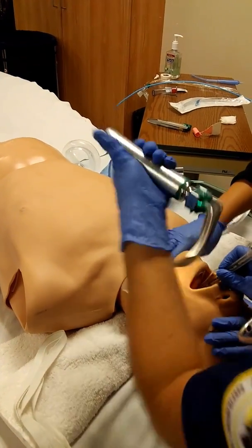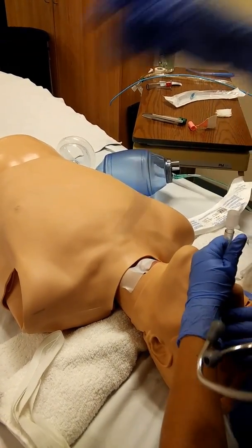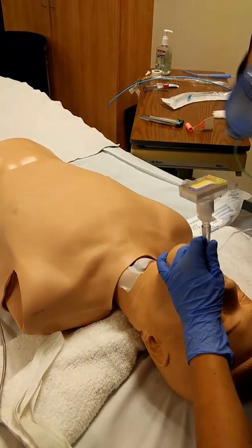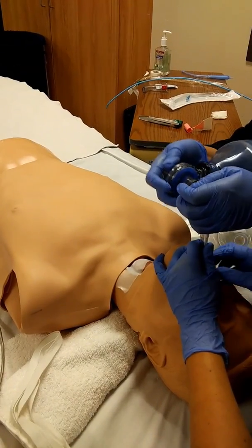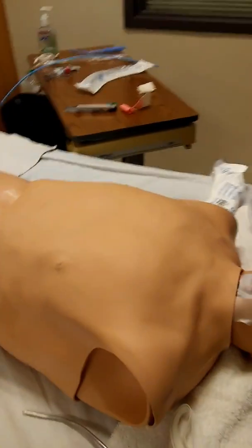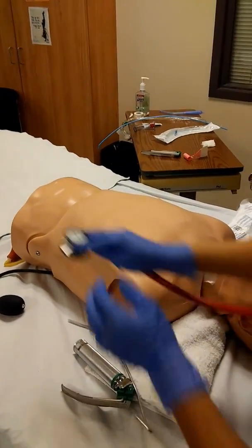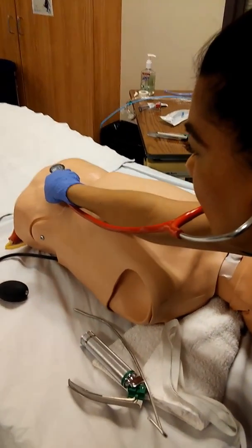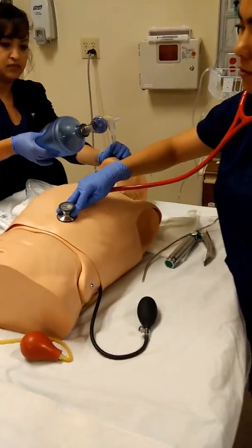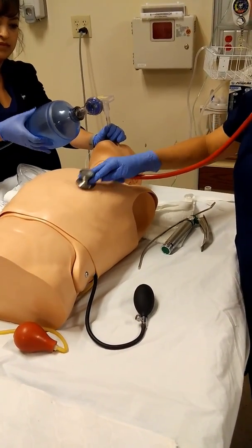Okay, so I'm just going to be careful here. Going to remove the stylet. Okay, going to inflate the cuff here. If you could just hold the tube for me, please. I'm going to check the patient's stomach first. Listen. Check the stomach, make sure I don't hear any air in the stomach, which I didn't. So now I'm going to bilaterally check and listen to the patient's breath sounds. And listen bilaterally. Okay. There we go.